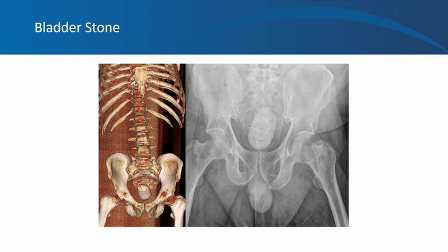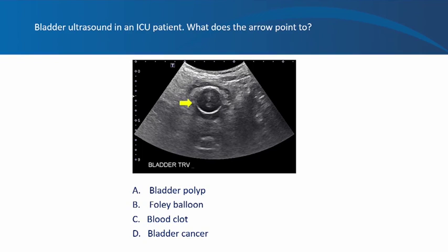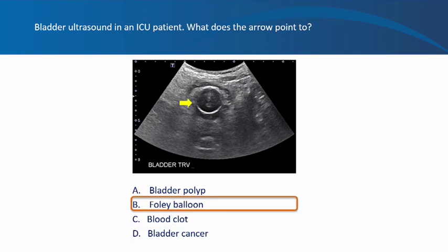Next question: this is a bladder ultrasound in an ICU patient — what does the arrow point to? Is it a bladder polyp, the balloon of a Foley catheter, a blood clot, or bladder cancer? We should not evaluate bladder cancer, polyps, or wall characteristics when the bladder is not filled with urine — doing so risks false positives. The arrow points to a very well-defined, fluid-filled structure, which is most likely the balloon of the Foley catheter. The surrounding area is the decompressed bladder.